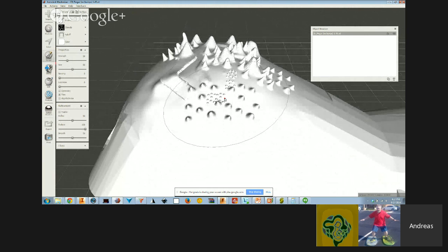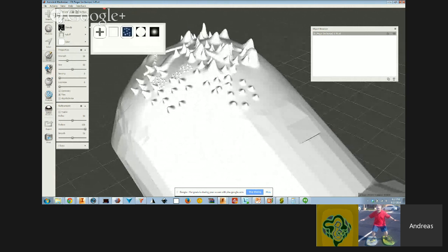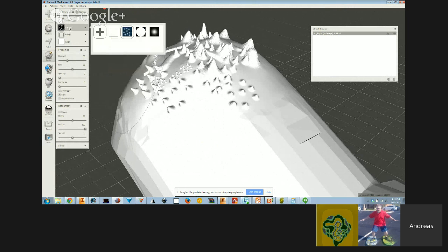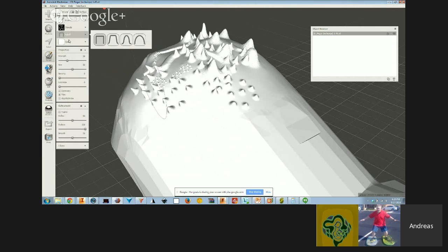Well, so that's just basically using a stencil with one of the sculpt brushes. This is kind of just scratching the surface at some of these things. So again, I toggle this over to surface, and I use this draw max, and then I added a stencil. You can import one from your hard drive using this. Change your falloff to full or not, and then make your brush size the size you need it, and you can start to adjust that geometry. Again, you need to make sure you have the geometry there.